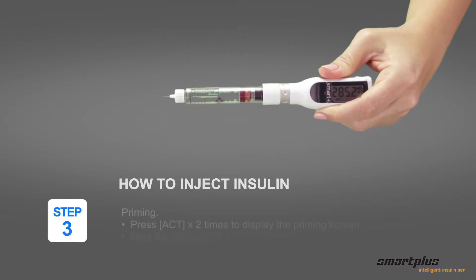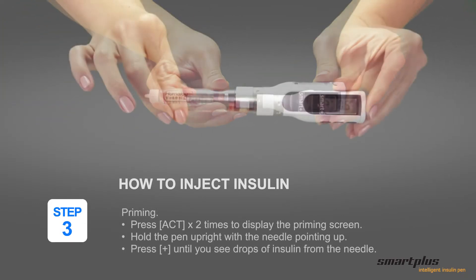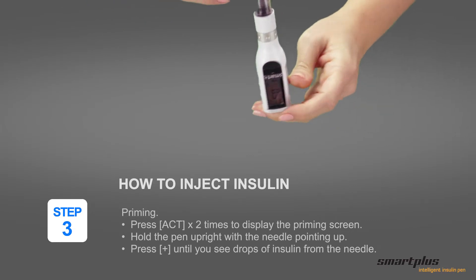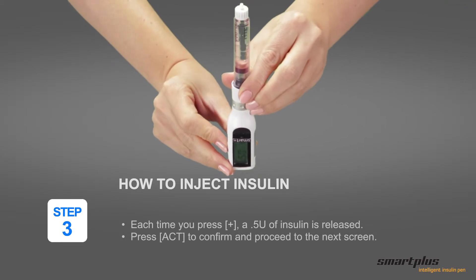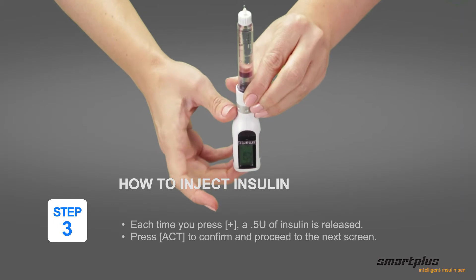Step 3: Priming. Press ACT twice. The priming screen is displayed. Hold the pen upright with the needle pointing up. Press plus until you see drops of insulin from the needle. Each time you press plus, 0.5 units of insulin is released. Press ACT to confirm and proceed to the next screen.